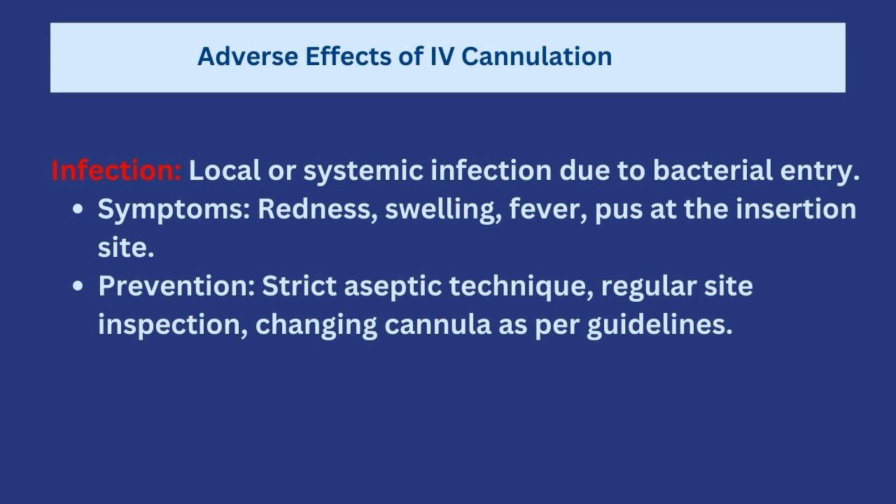Usually, it is advisable that a cannula should not stay longer than 72 hours. And if the cannula is no longer in use, it is best to always remove it, even if it has not been up to 72 hours, except there is a need to keep that cannula in situ.